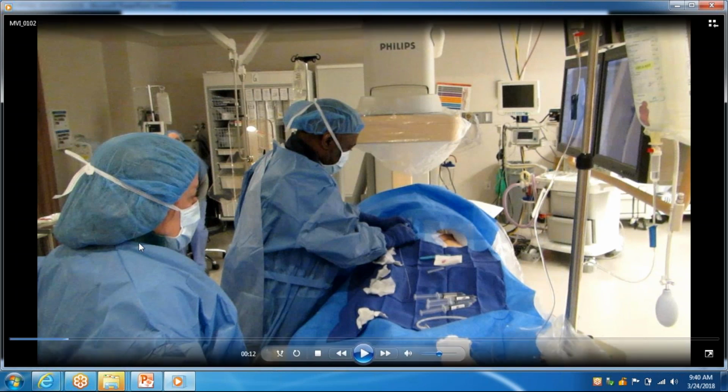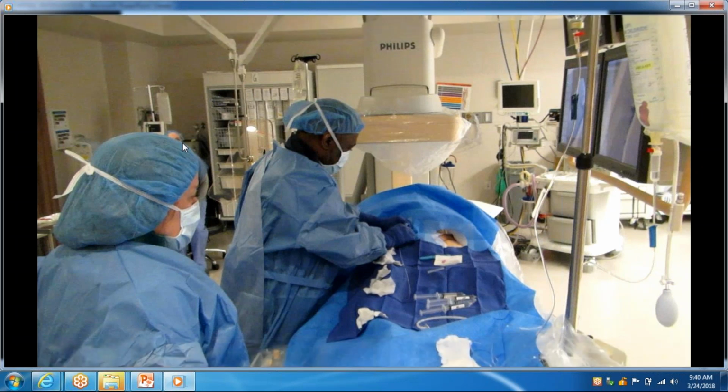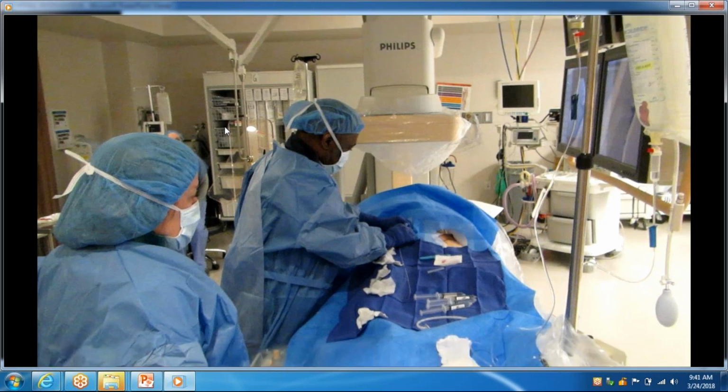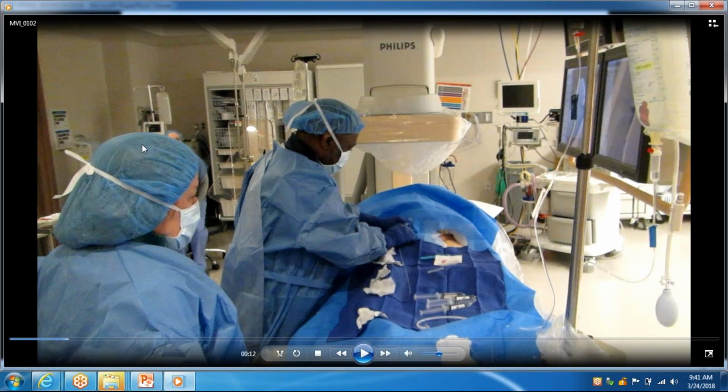So you have your assistant, you have a floating nurse, so if you need any medications, you need anything. You'd also have a floating technician that will help get you whatever catheter you need, whatever else. And then you have another technician who's monitoring.